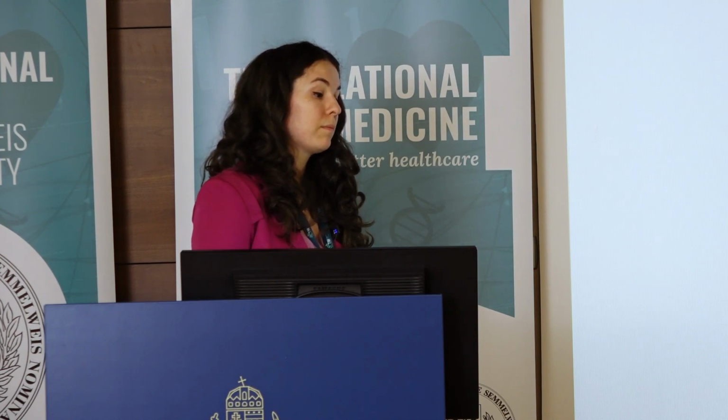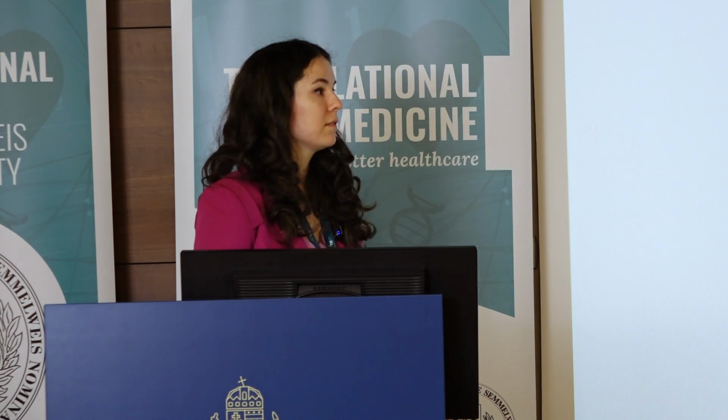And if I am a prosthodontist and I want to use scanners for full mouth rehabilitation, I would choose the ones which are good for full arch scanning. For example, the 3Shape TRIOS scanner was a good choice, and also PrimeScan had very good results, even if it is said to be a chairside system, but the full arch scanning was very good in this case.